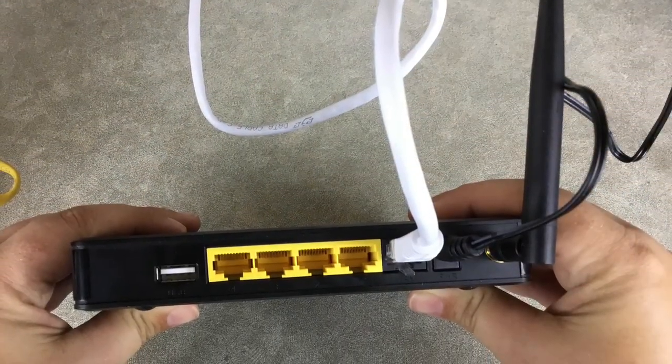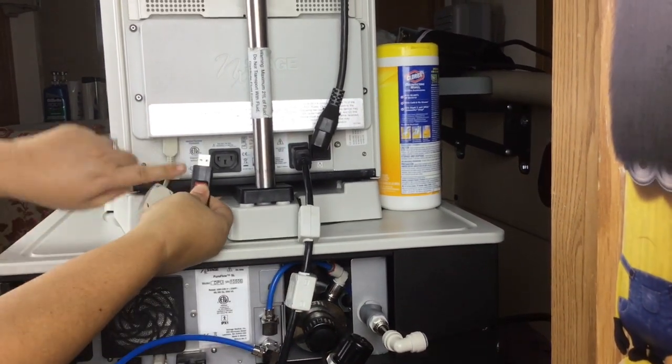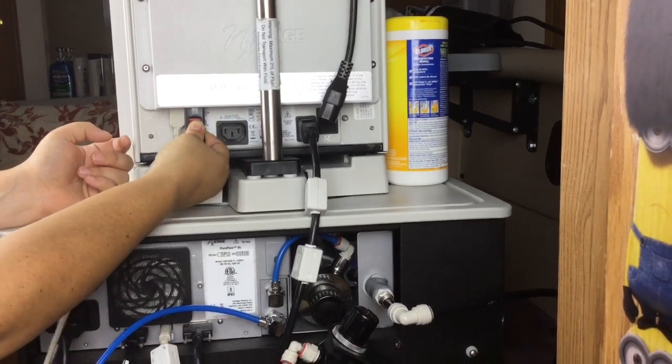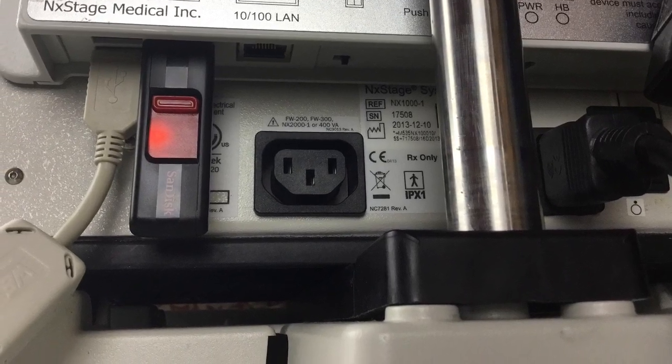Before updating the software, make sure that your cycler is plugged in and turned off, and your PureFlow is turned off or is in standby. Plug the USB drive into any of the available USB ports on the underside of the Connex box. Wait at least 5 minutes to be sure the upgrade processing is complete. Now unplug the USB drive from the Connex box.